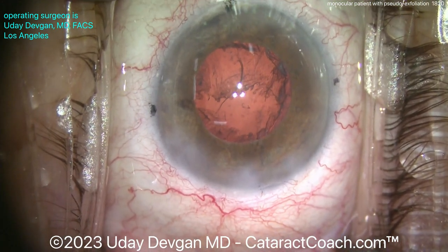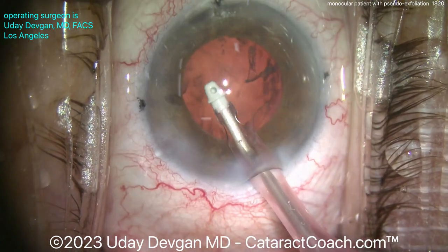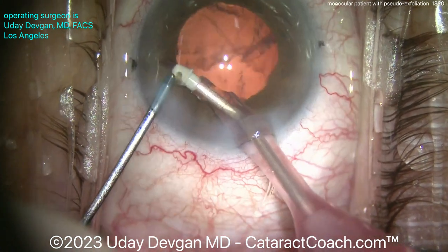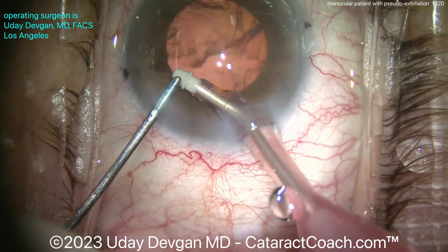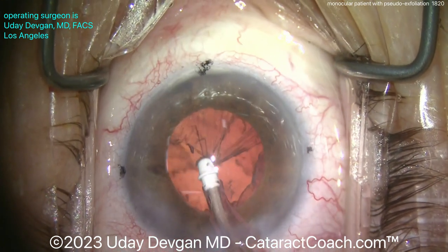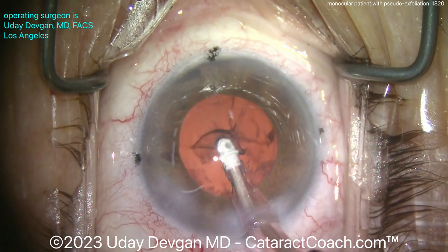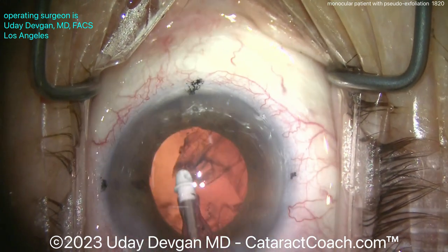You may think the hard part's over — no, no. Cortex removal is critically important because you can put so much stress on the capsular bag and zonular support during cortex removal that you can break a zonule. It looks like there's a little tiny fragment of a nuclear chip — we'll push that into the probe. Now taking out the cortex, watching the rhexis edge to make sure it's not moving — that would be a bad sign.